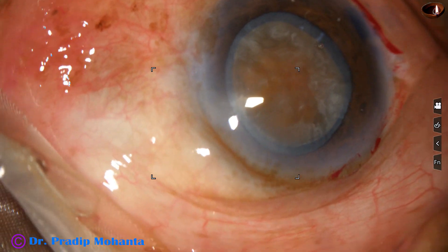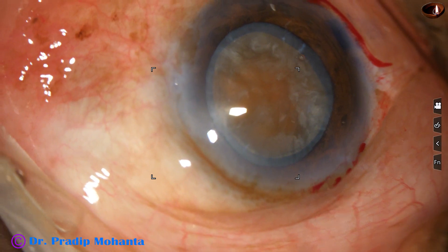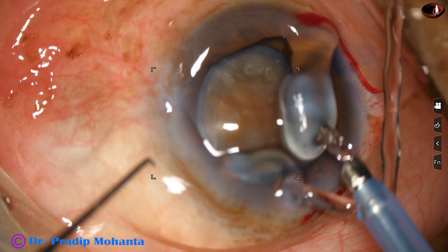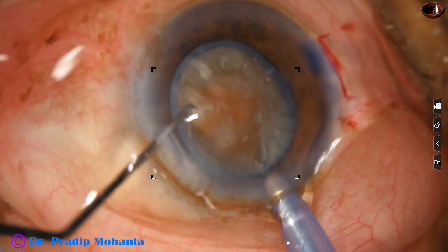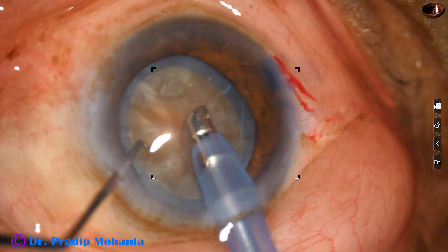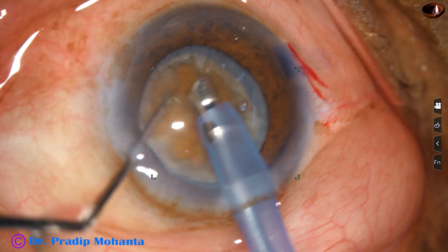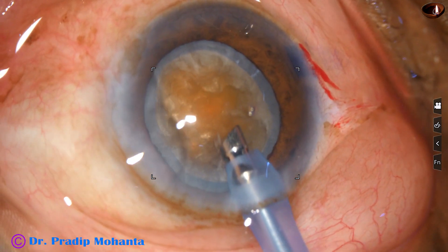The nucleus has been mobilized. Visco has been injected in the anterior chamber. And now the phaco needle goes in with its bevel down, and some superficial lens matter is removed. We can see the brown nucleus.